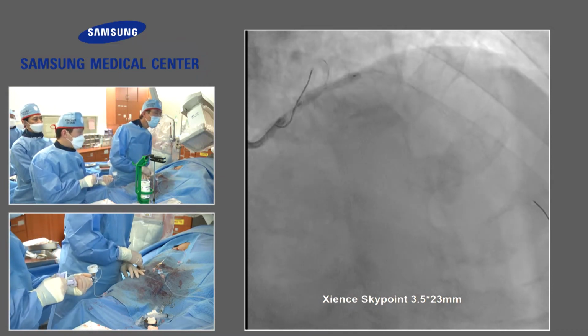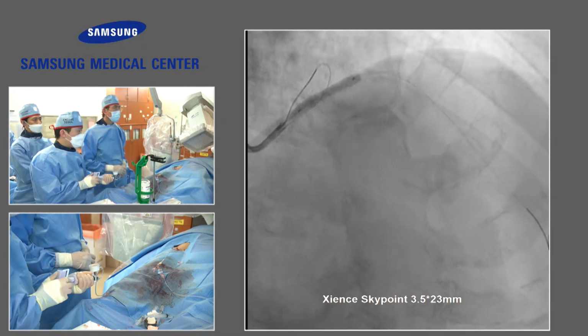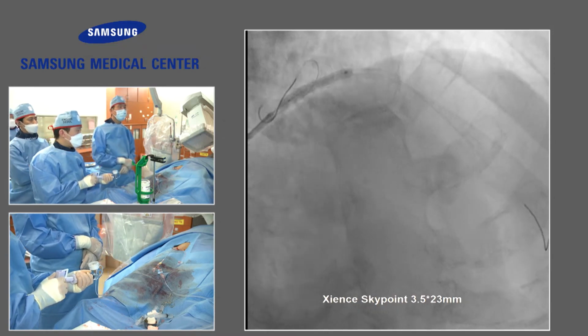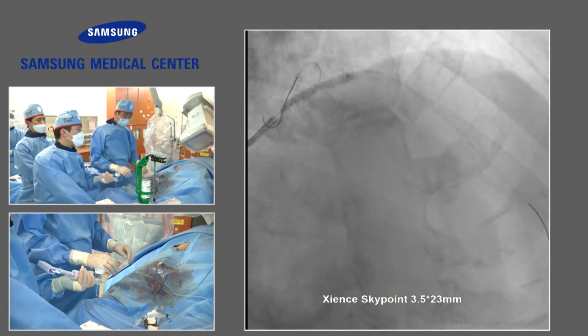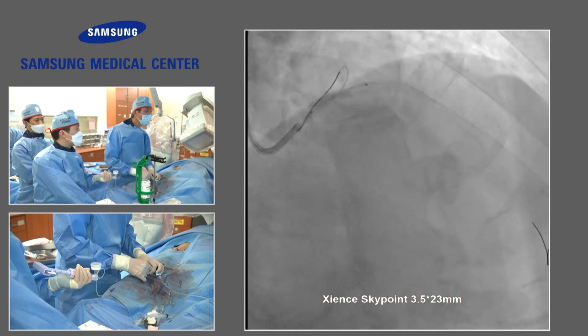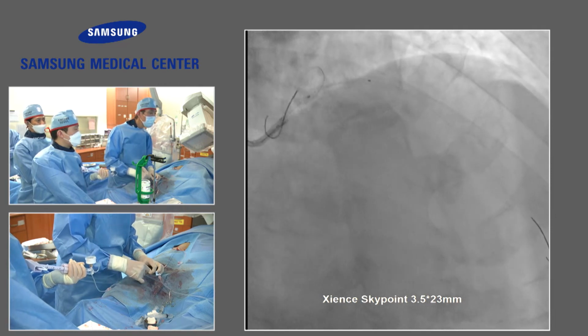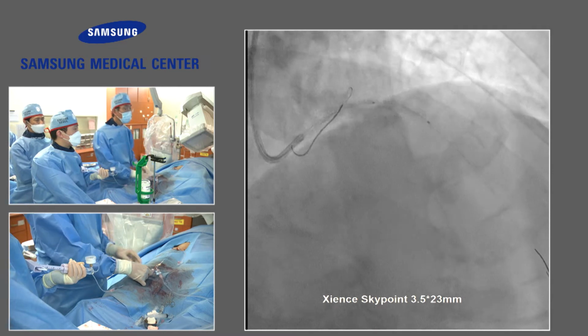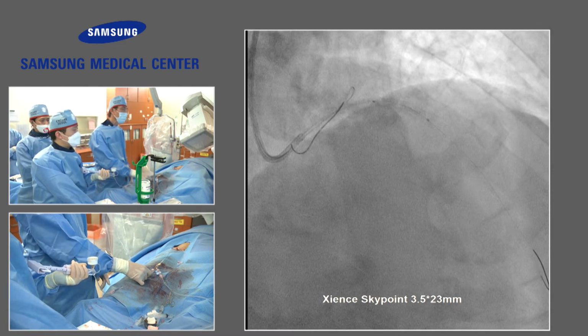The stent and the proximal LAD and the left main in the cranial projection. But if you do that, the younger interventionist learns that way. Deflation? And the similar way of it. Usually proximal vessel intervention was recommended. It is not the cranial view, but I should recognize the clear location of the stent position.